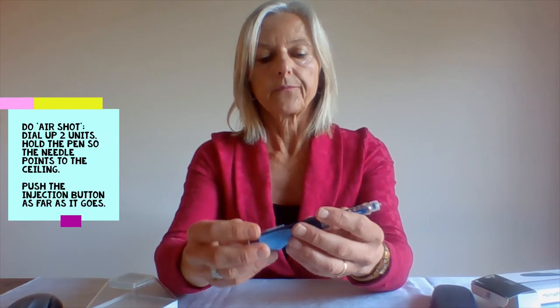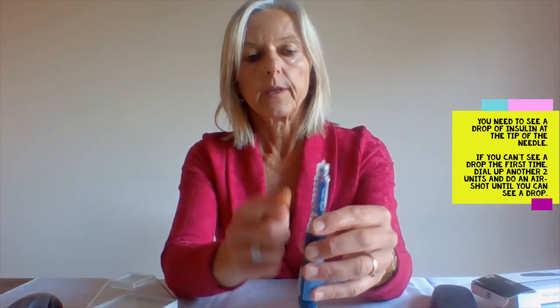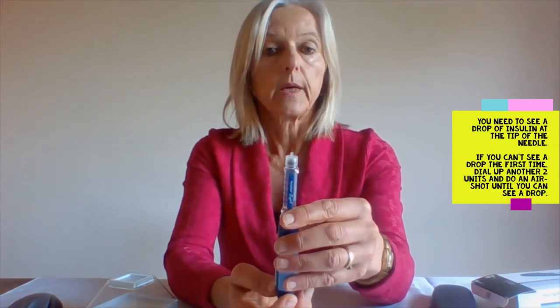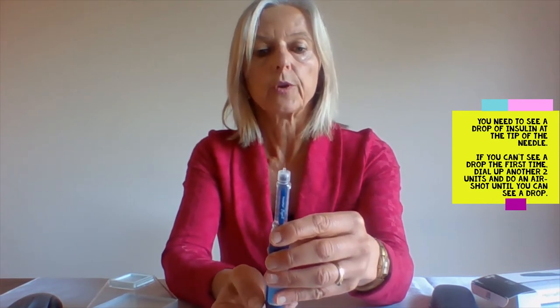You then do what we call an air shot. To do that, you dial up two units and hold the pen up towards the ceiling and push the insertion button all the way up. You need to observe a drop coming out of that needle. If you can't see a drop, you need to dial up more units until that drop is visible.